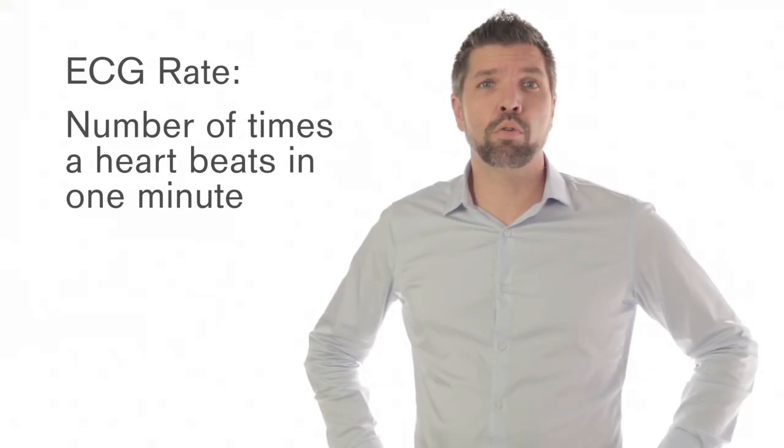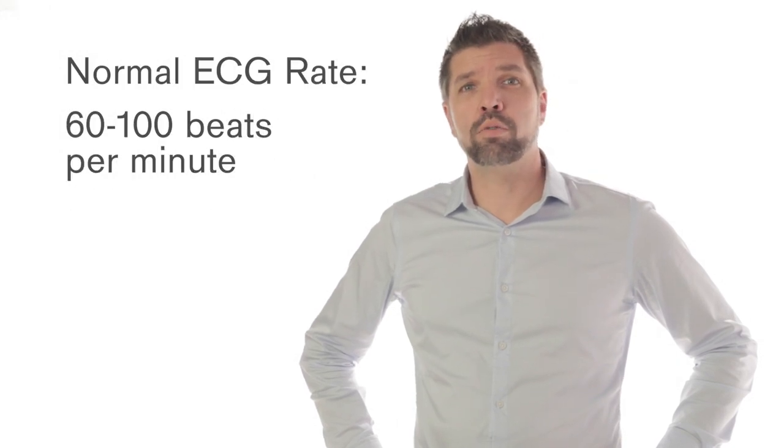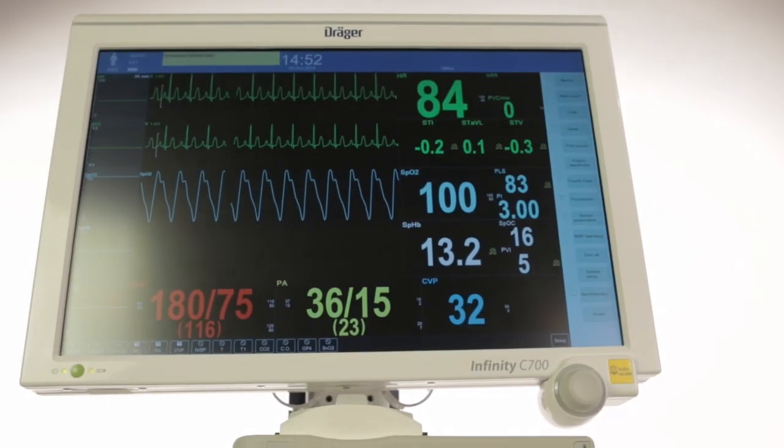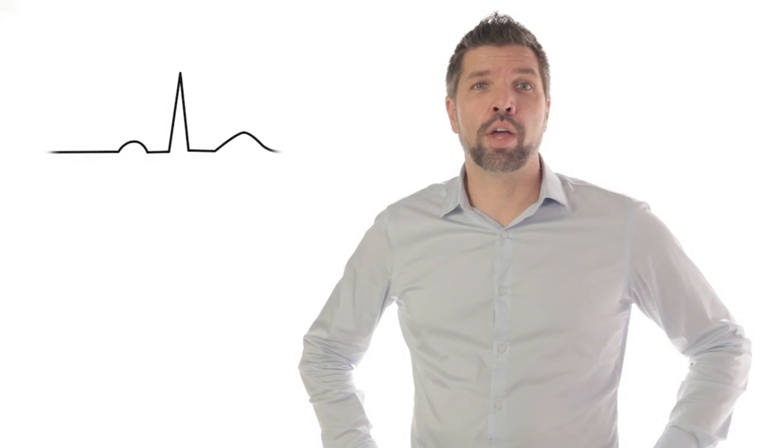The ECG rate is the number of times the heart will beat over a minute. The normal is situated between 60 to 100 beats per minute. It is easy to do a calculation on an ECG rhythm that shows regular intervals. When faced with arrhythmias that make it irregular, a device like a cardiac monitor and ECG card can come in handy. Let's take a look at the visual representation of a heart contraction.